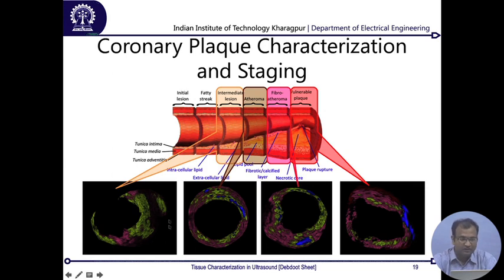Still it is going to predict and there are no false positives coming up. This is a stage when in these two stages also there is no necrosis coming and it comes only over here. So there are missing classes in the data itself, and it's still very efficiently going to predict it out, including learning them perfectly.